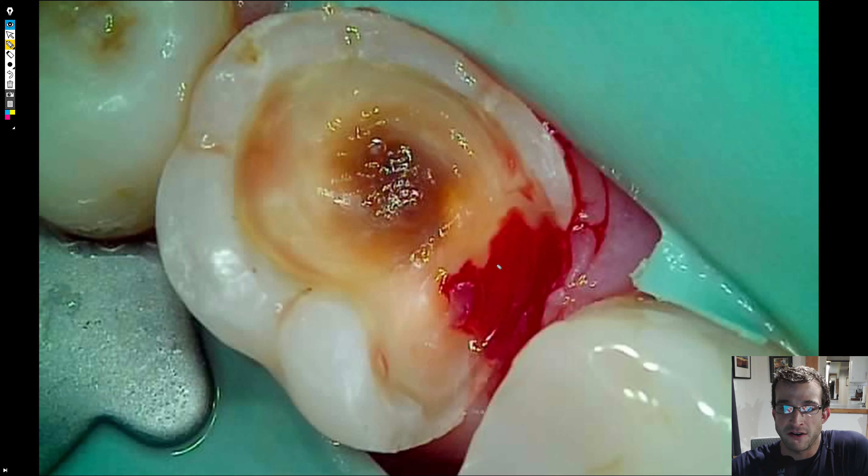I'm also planning on posting more of the raw footage of the procedure so that I can scrub through everything for a more authentic experience, as opposed to the trimmed videos that just show the stuff that goes well. This one's trimmed, so we'll get into it. It's a 4.7 MOL.